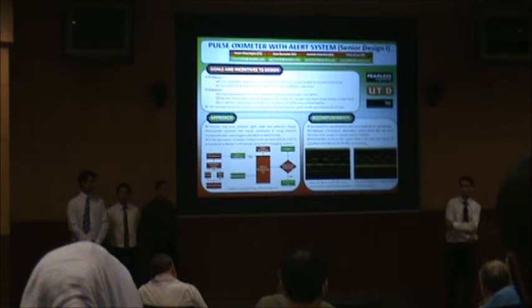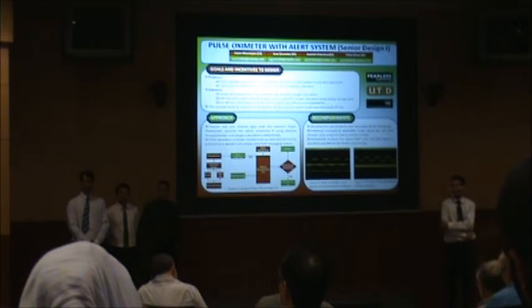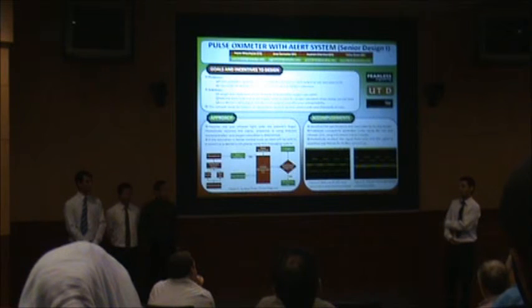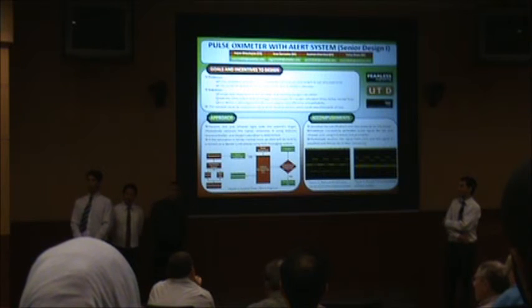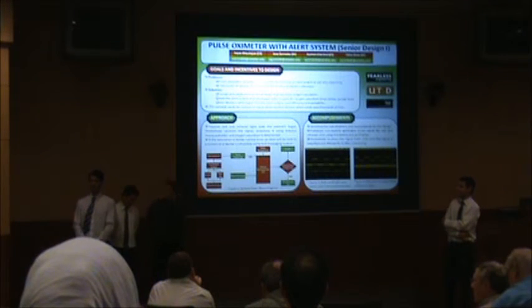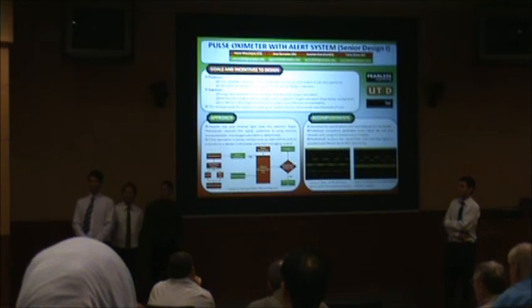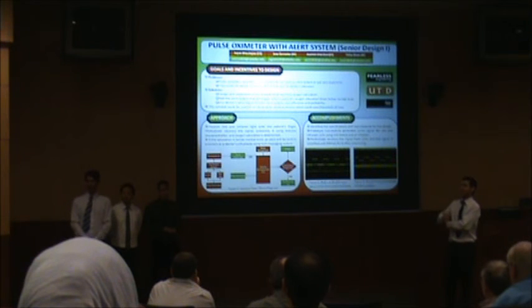Last question. Do you have any testing set up for phase two? Who are your customers you're going to test? For the testing, we can test by ourselves right now, and we can see the oxygen saturation very quickly. If you wait about 10 seconds, you can see the differences, like the tracing, and you can check with it. But we don't have a test situation yet. You have to compare it against some standard. Yes, sir, we already bought one. That's the gold standard, actually.